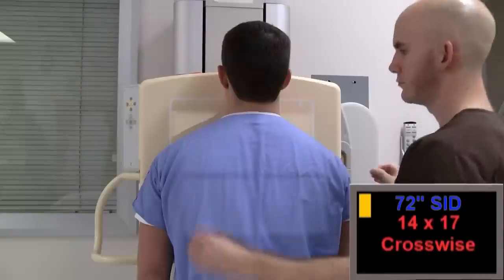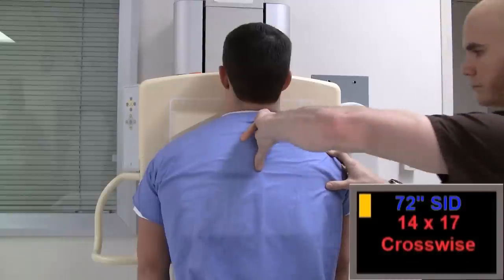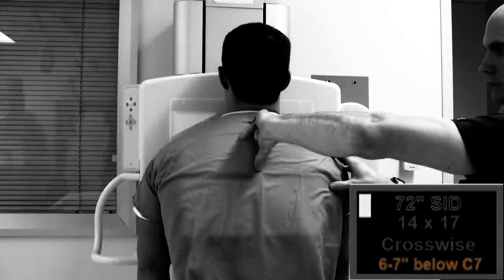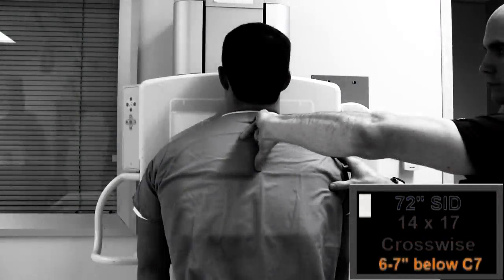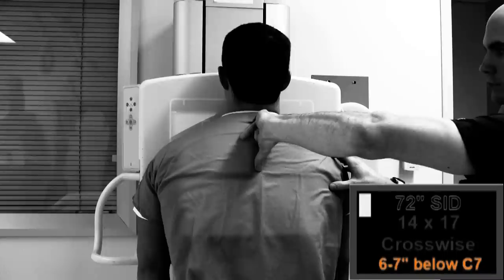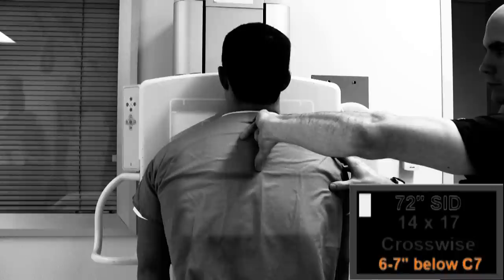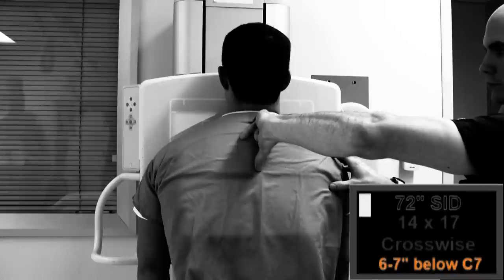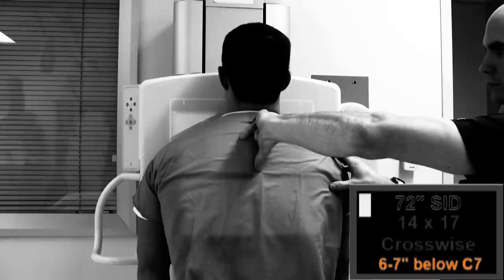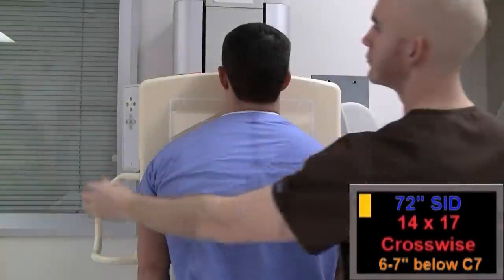With the patient's hands on their lower hips, have them rotate their shoulders forward against the image receptor. This rotates the scapulas away from the lung fields. Center the central ray perpendicular to the image receptor, centered to the mid-sagittal plane at the level of T7. This is approximately seven inches below the spinous process of C7.